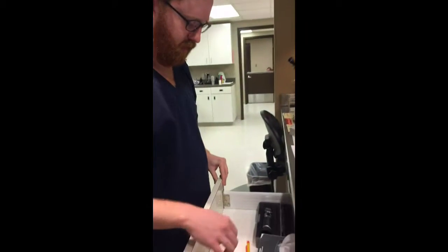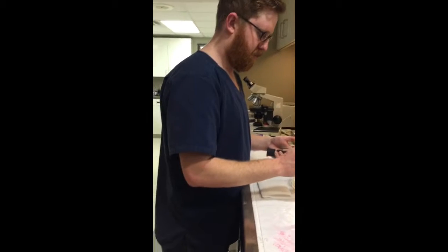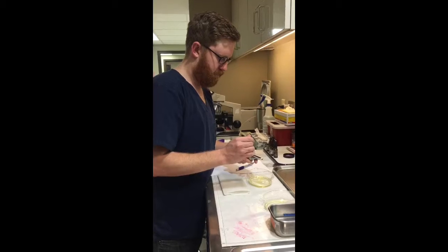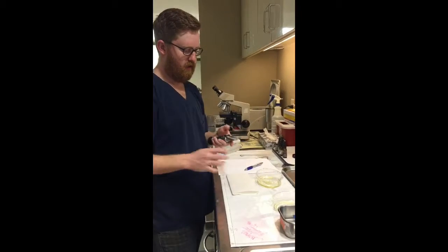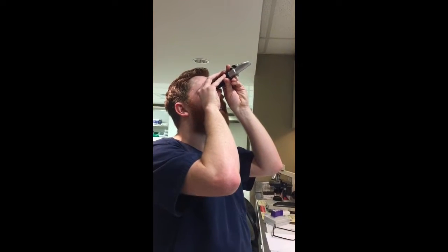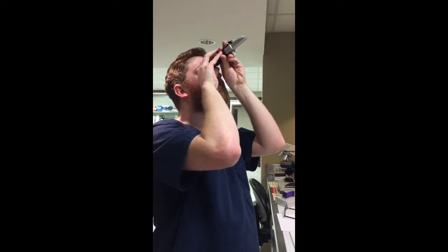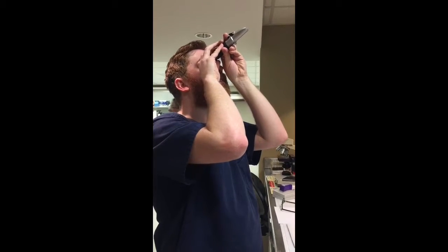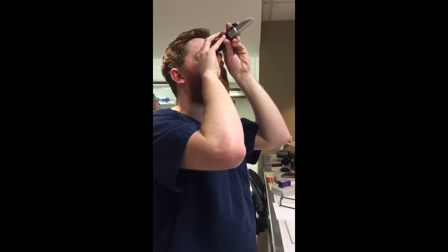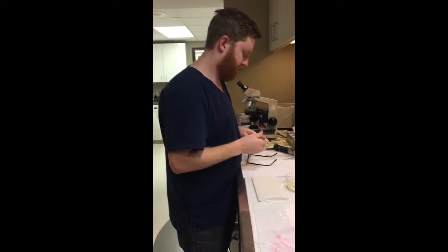I'll go ahead and get my specific gravity on the refractometer, and it just takes one drop. Okay, I'll go ahead and shut that, and hold the refractometer to the light. Okay, and it looks like his urine's right at 1010.